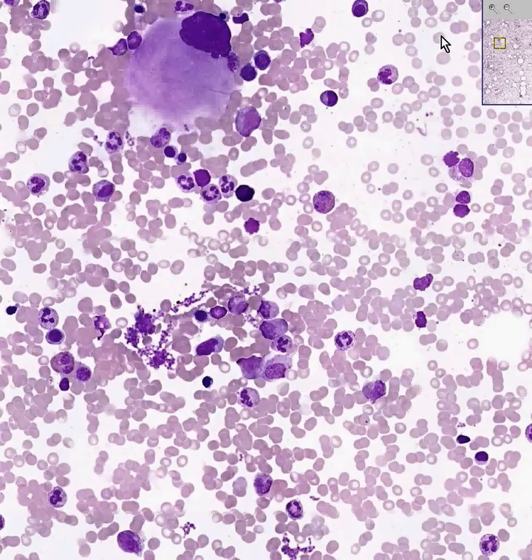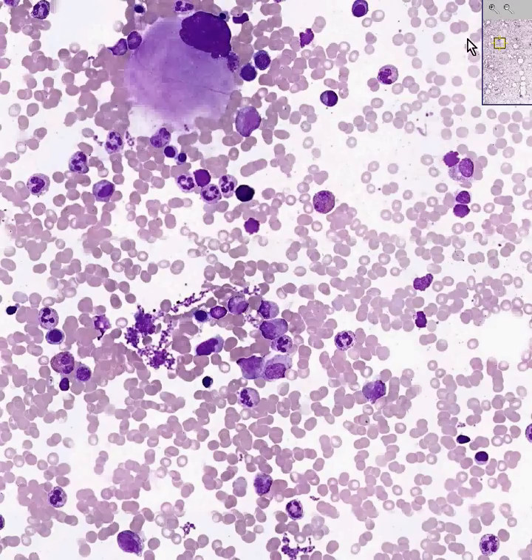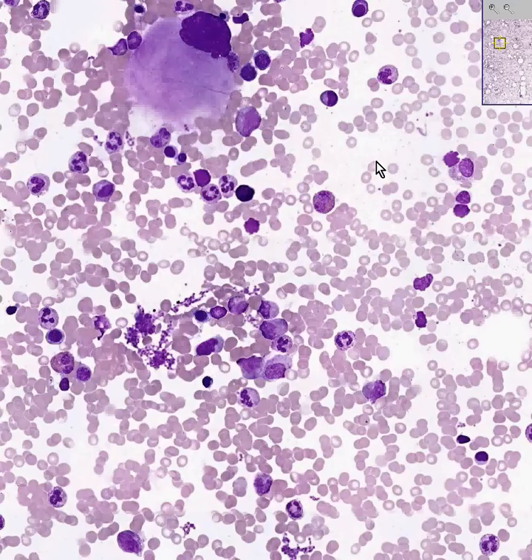Now that we've got one of the three lines of development out of the way — the platelets — let's look at the red cells and the white cells. Even though red cells are about a thousand times more common than white cells on a peripheral smear, in the bone marrow the ratio is reversed, because white cells have a tremendously shorter lifetime than red cells, so they have to be turned over faster.